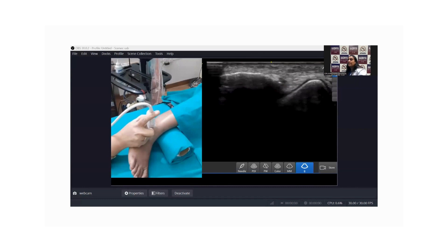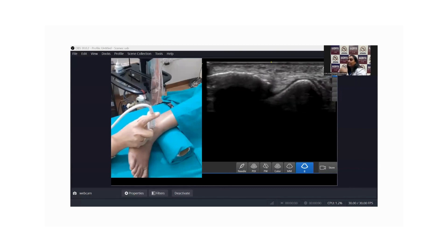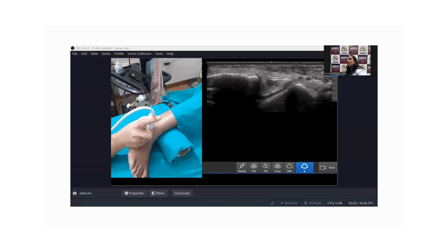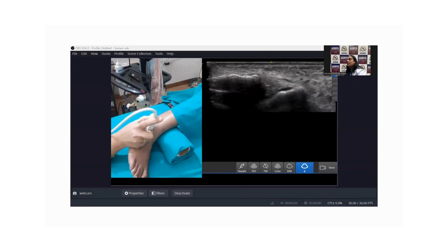Even in this position you will be able to see the ATFL, and you can see it has got two bands — the superficial and the deep one. But to better orient your probe exactly in the line of the fibers, tilt the end of the probe which is towards the talus towards the ball of the great toe. The moment you do so, you will be able to see the ATFL very beautifully.